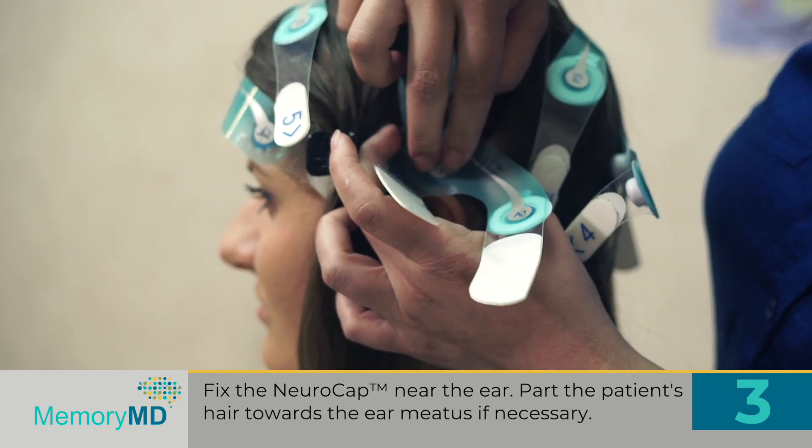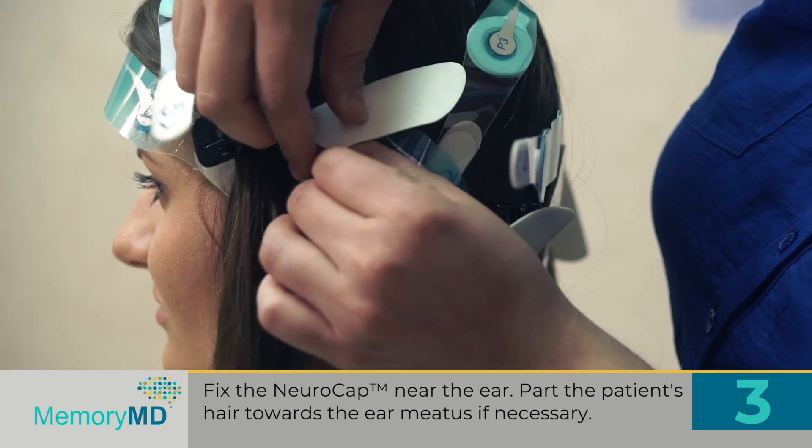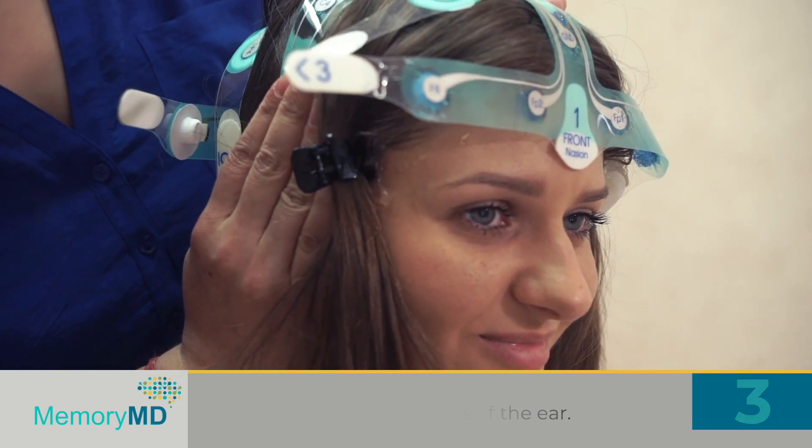Step 3: Fix the NeuroCap near the ear. Part the patient's hair away towards the ear if necessary. Next, remove the protective film and stick the NeuroCap to the sides of the ear.